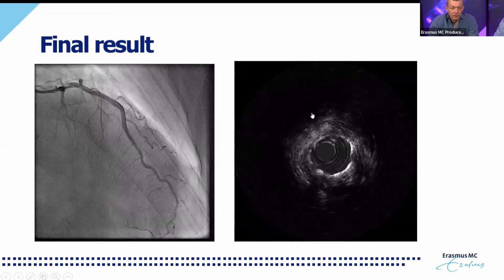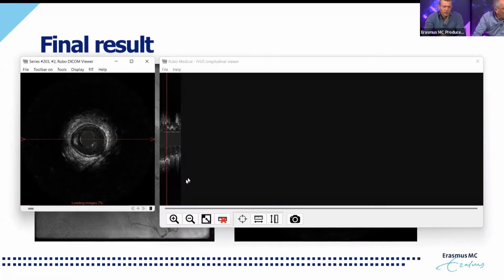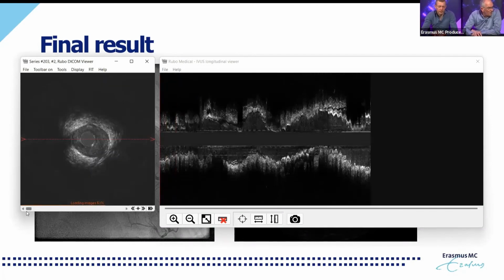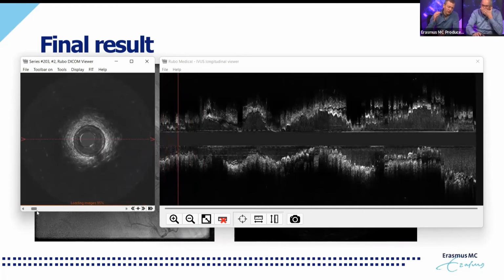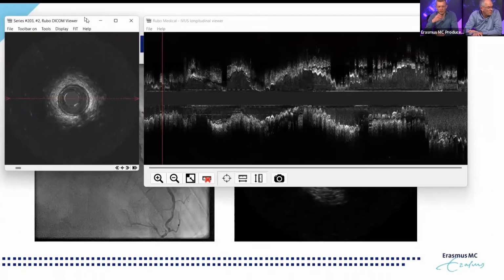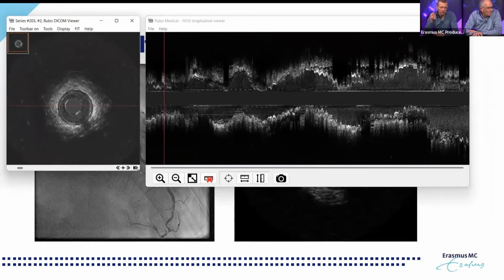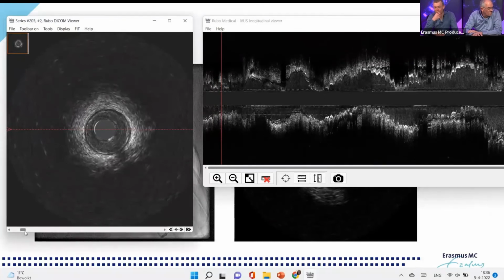And then we repeated, obviously, the imaging. Again, this looks very elaborate, but at the end, it's not. If you have your wire in and you do your post-PCI physiology, obviously you need the time. If you use intravenous adenosine, you wait a bit, and then it will take you at least 3 minutes to do the hyperemic assessment. Also, with the ACIST system, you can get your diastolic pressure ratio, so that is already a big advantage and saves you at least 2-3 minutes per case.